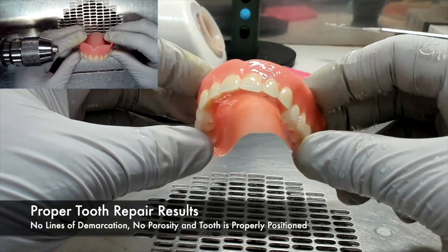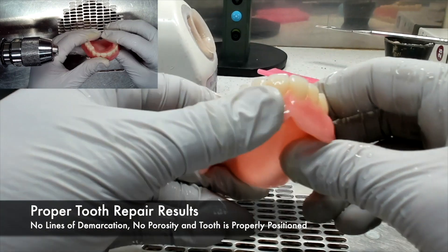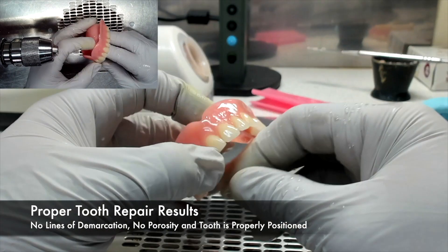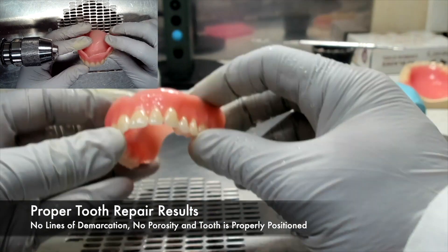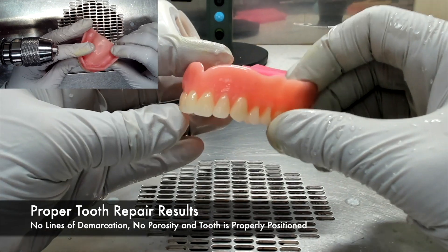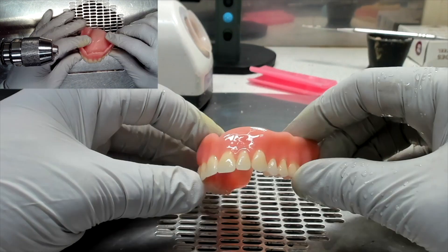The results of a proper tooth repair are shown as: no lines of demarcation, meaning you cannot tell where the old and new acrylic begin and end; no porosity in the repair acrylic; and that the tooth is still properly positioned.